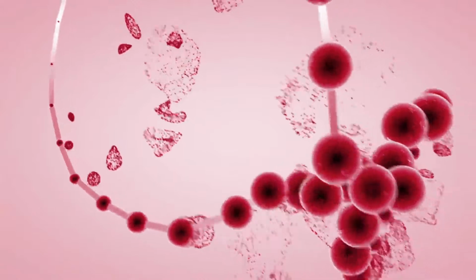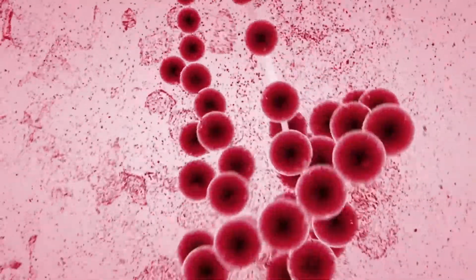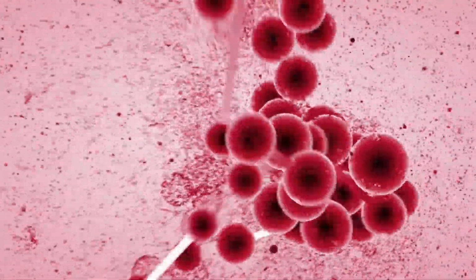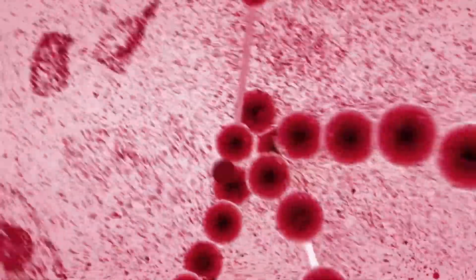Although areas of intense activity on a positron emission tomography scan may indeed be a cancer or other undesirable medical condition, sometimes relatively normal cells can be highly radioactive under the scan. An example of one of these situations is tissue inflammation. If a patient does not follow pre-test instructions to fast, the body's cells, such as the muscle cells, may take up the radioactivity and cause a false positive result.